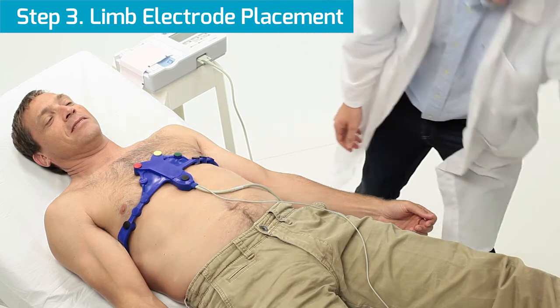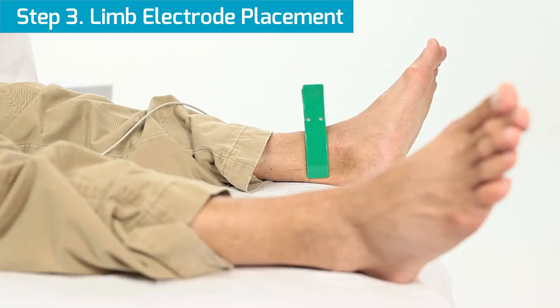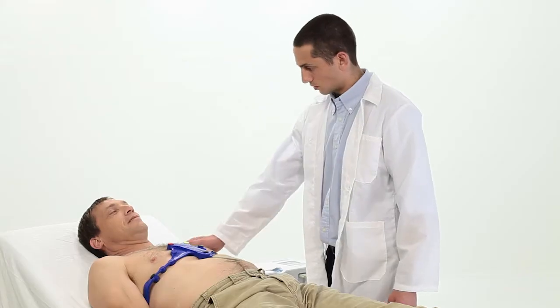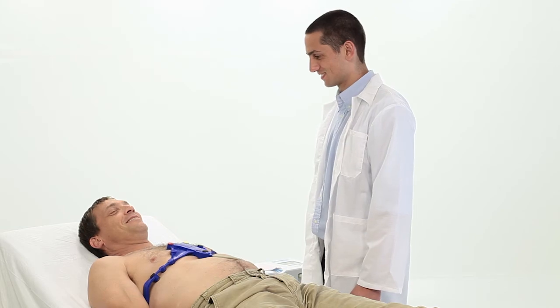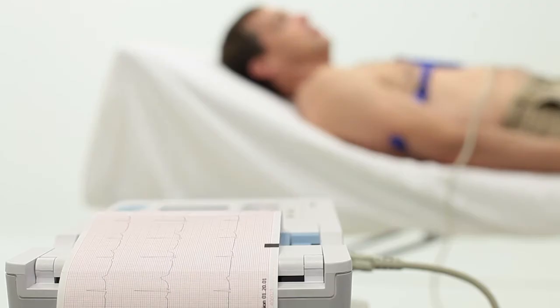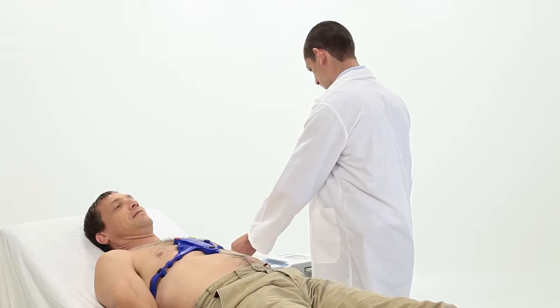For the third step, simply follow your standard procedure to attach the left leg electrode. Then ensure the patient is relaxed and does not strain his or her muscles. Ask the patient to try not to move or talk during the assessment.